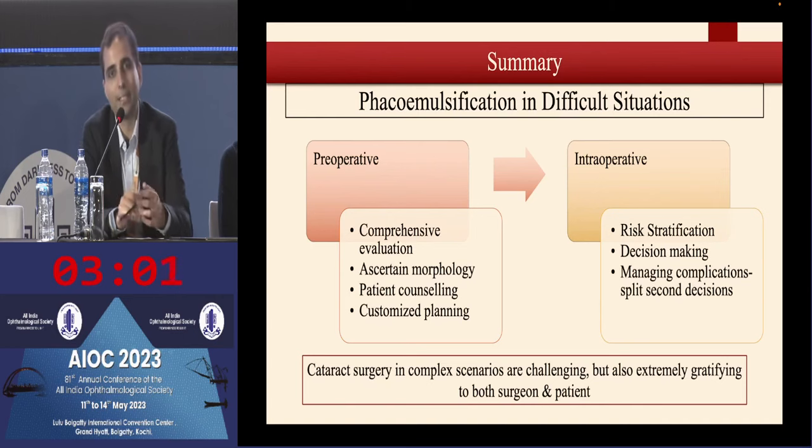But like sir correctly mentioned, be careful in choosing the first few initial cases, because the surgery itself may lead to a couple of RK incisions opening, suturing, and then the astigmatism will probably go for a toss. And I think even if there is a gap between the 2 incisions, it is always better to take a slightly scleral incision, because we never know what maneuvers may lead to a split in the incisions.